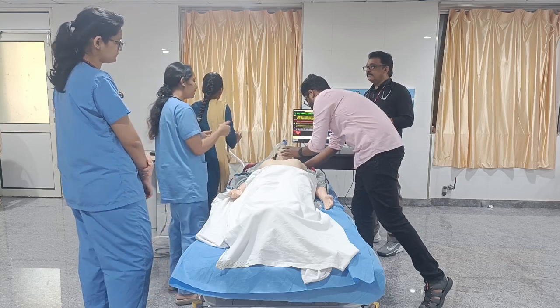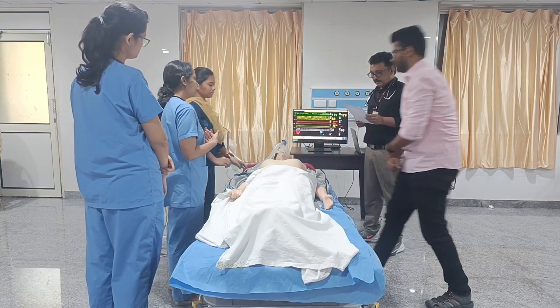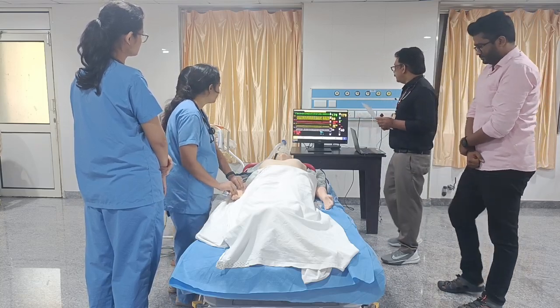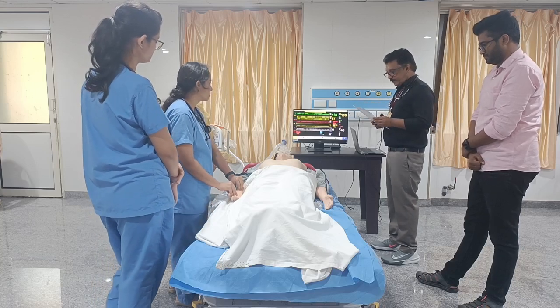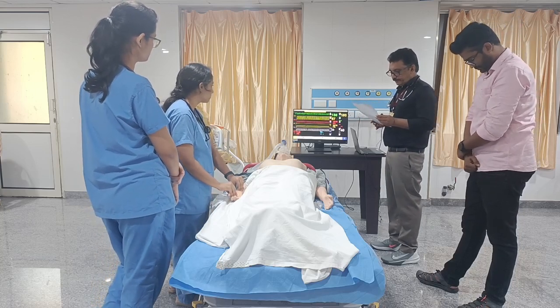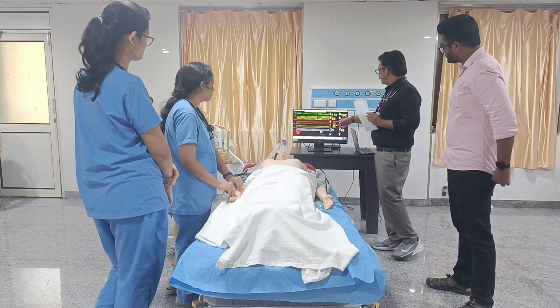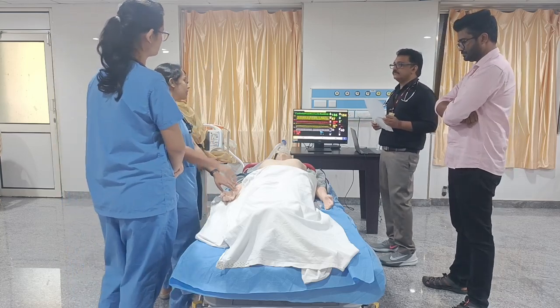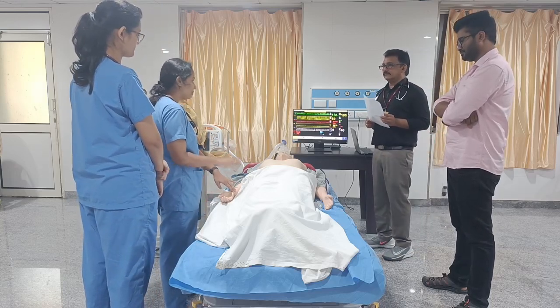Then we come to the circulatory part. You can see the pulse. It is connected to the monitor. Heart rate is around 180 beats per minute, and it is totally irregular. BP is on record. It is 79/40. In the circulatory part, first of all, we will ask to secure 2 large bore IV cannulas.